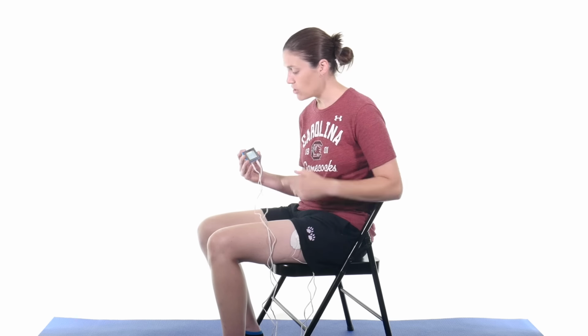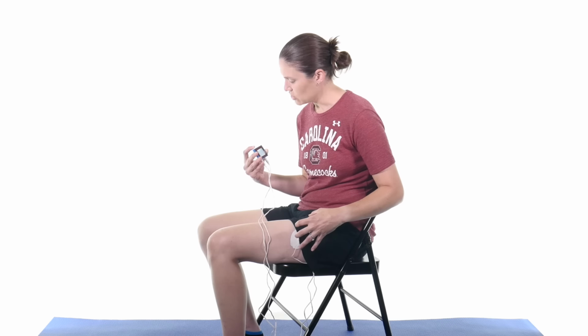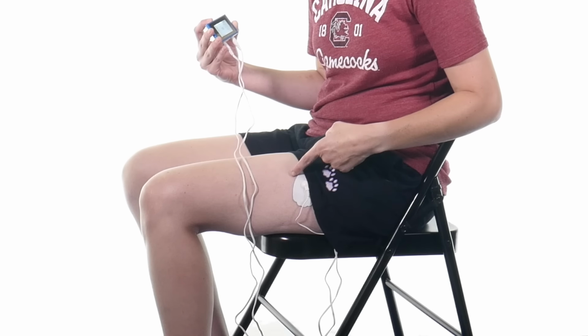So this one is the one I like a little bit better. It kind of ramps up nice and slow and comes back down. But so you can see I have it on. I have it about setting three where it's pretty light for me. I would want it a little bit stronger. But again, you shouldn't really see any muscles contracting. So I'm going to see. I'm not sure if I have it in a spot, but I'm going to take it up and see if I can get some. So there is a contraction there.